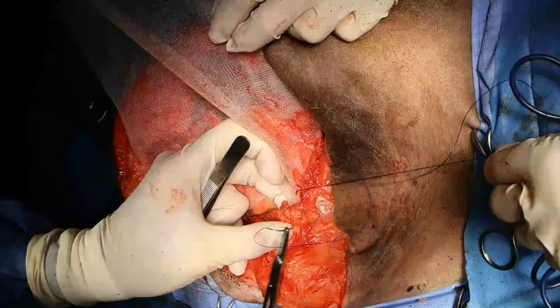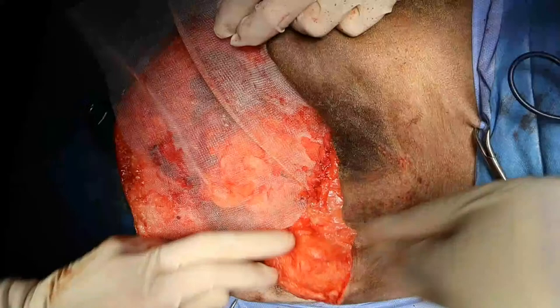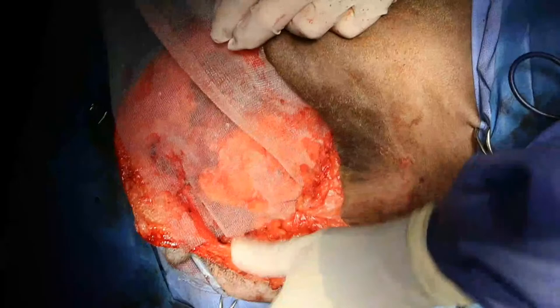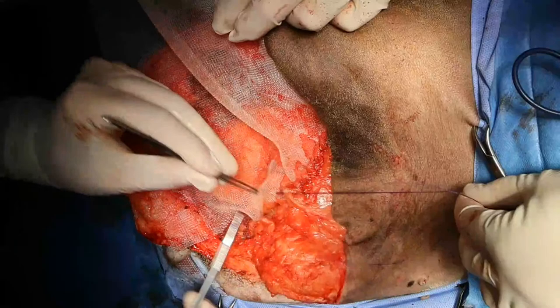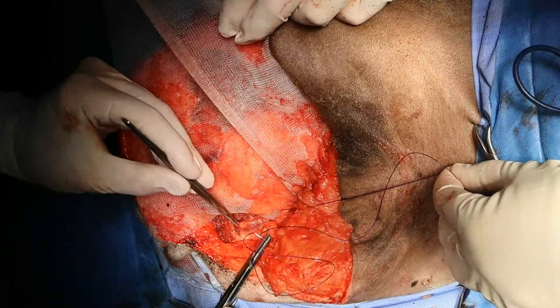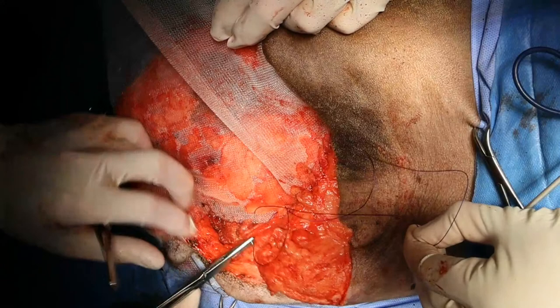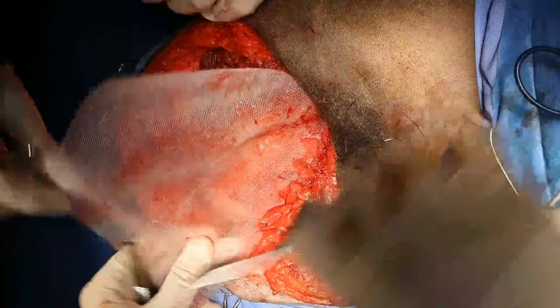So I'm just suturing through the prepubic tendon and into the polypropylene. Once I get to the end of the prepubic tendon, I'm going to start suturing it to the adductor muscle on the opposite side. I'm just recreating an abdominal wall because otherwise the bladder will poke through. So everything is just going to stay where it is now.